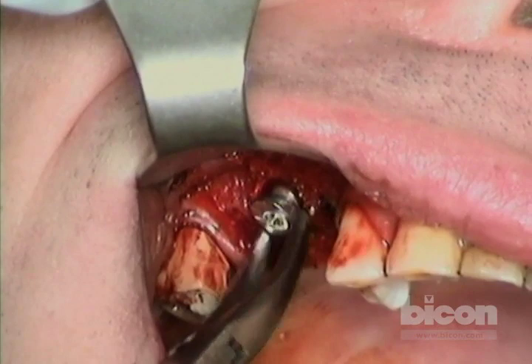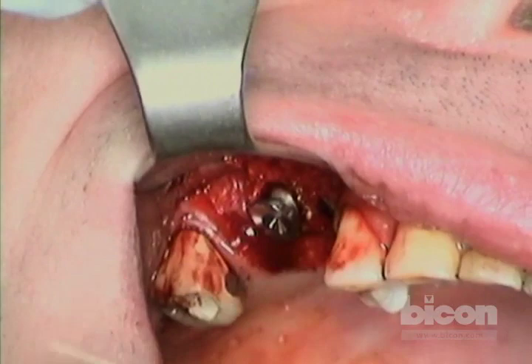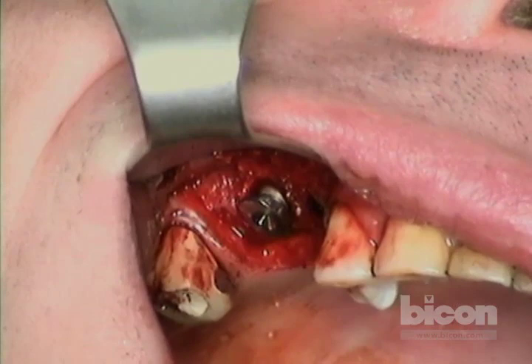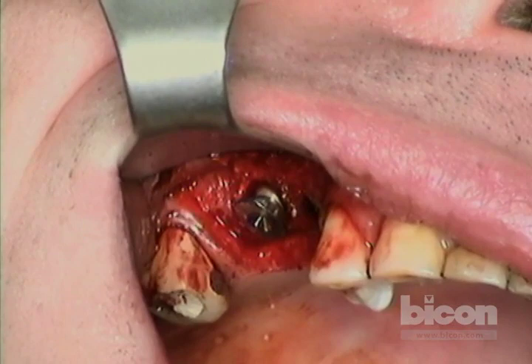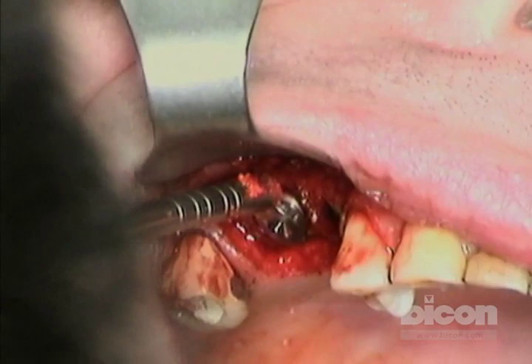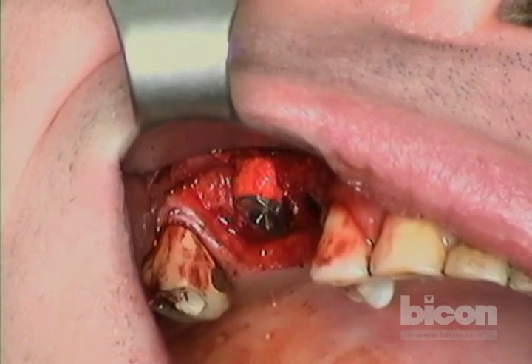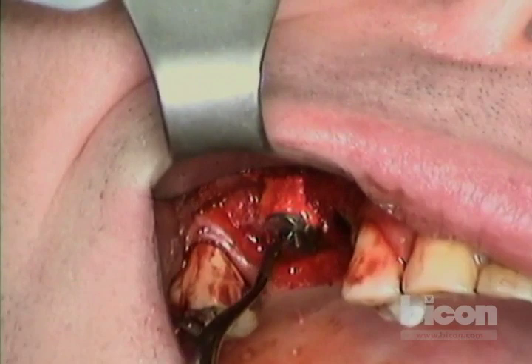This is going to create the best stability for this implant because it engages the rim of the osteotomy. There is a slight depression in the center that will allow me to use a three-millimeter point or nib. I'll give it some bone graft right underneath because I won't have access again. I'll pack it in, make sure it's where I want it to go. It is stable — let's keep it stable.